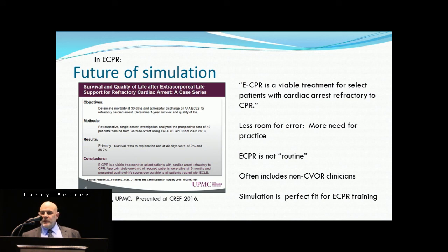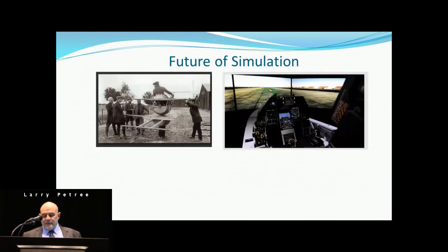ECPR is not a routine situation, so our normal perfusion protocols are not going to apply. If you're called into one of those cases, you probably have to be a little bit more creative. Where will the basis for that creativity come from? It'll come from all of your experience, including clinical, but perhaps also simulation. ECPR also often involves non-CVOR personnel. They will not be familiar with your technology, your equipment, or your language. So again, exposing them in a simulation environment could bring some real benefit.